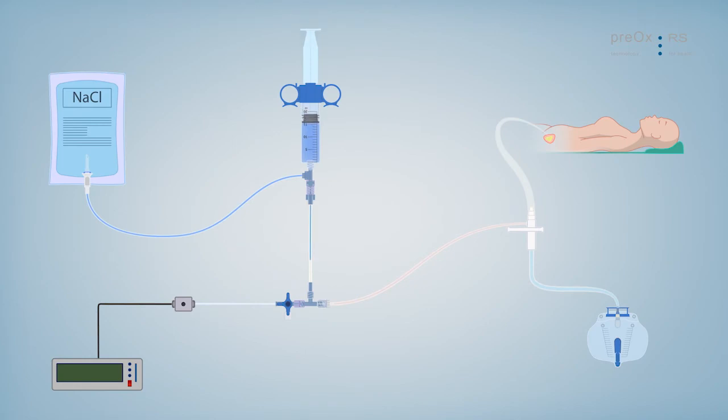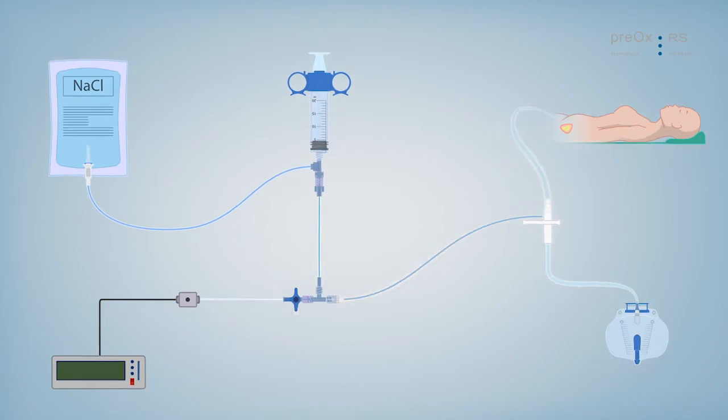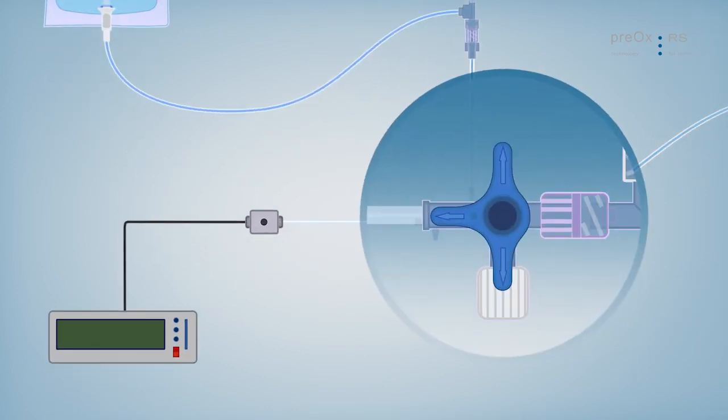Push the plunger to discharge the syringe to prime the tube system and bladder. Open the three-way stopcock clockwise by a 90 degree turn.